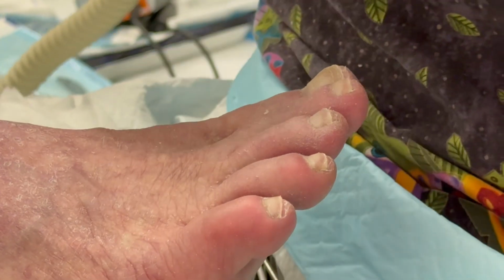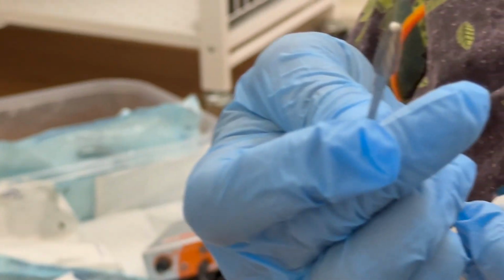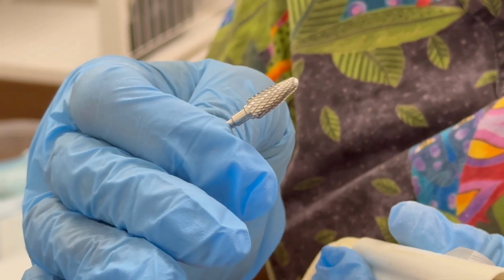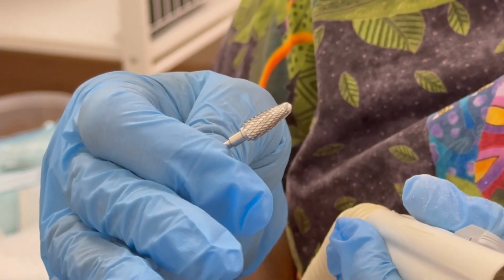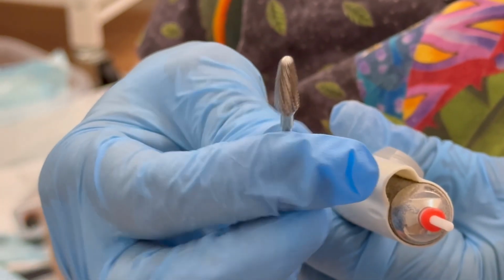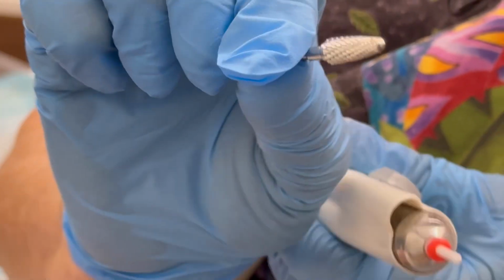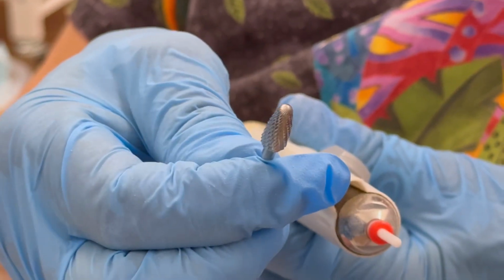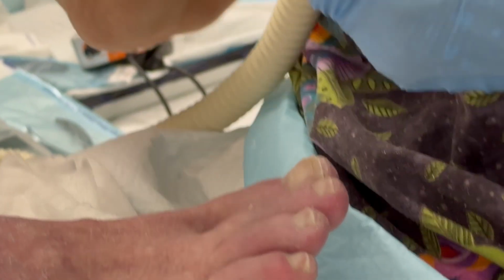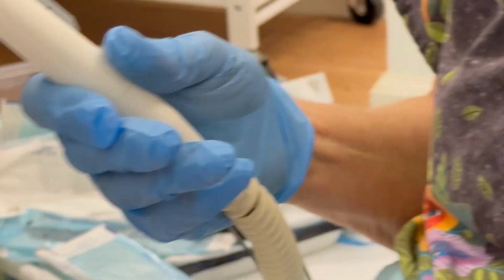And a carbide, let me see, where's the carbide? I think this is carbide, or it might be steel. This is ceramic. Sometimes I interchange carbide and ceramic. You guys, if I did it in the video, I don't know. This is stainless steel, I think. I don't use these very often. So there are lots of different materials, and I primarily use these ceramic ones now and diamond.